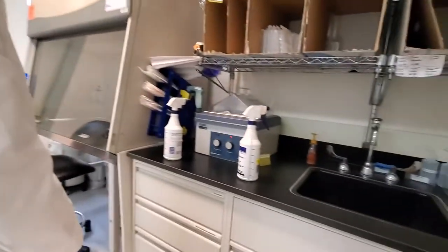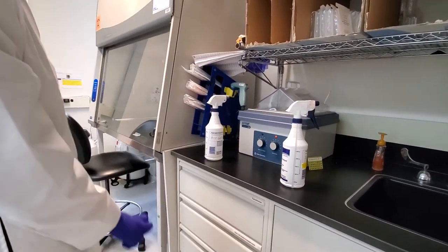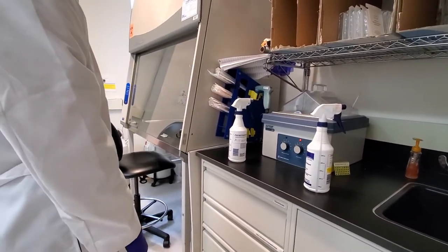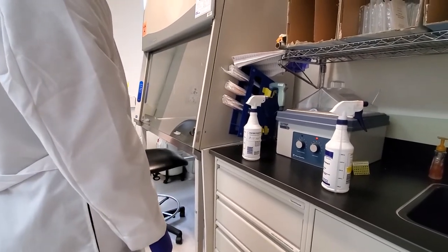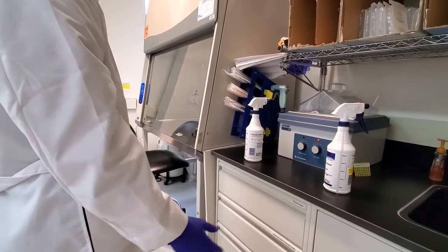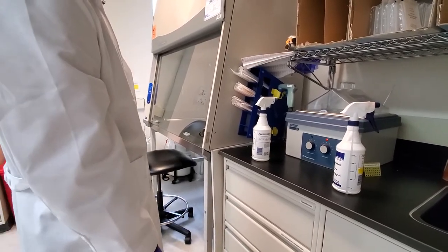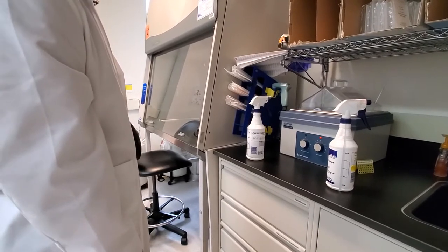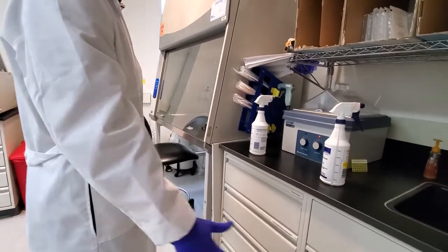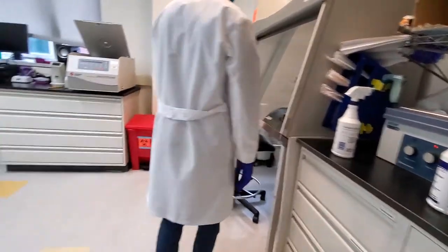I mean, different labs have different things they emphasize for cell culture, and some are more careful about it than others. We try to keep it clean, but it's sort of on the dirty side in terms of cell culture. We tend to have problems with fungus in this building, so we always include a fungicide in our culture media.